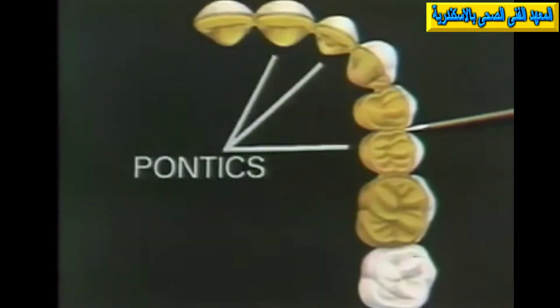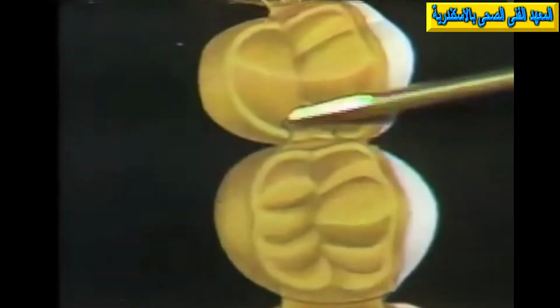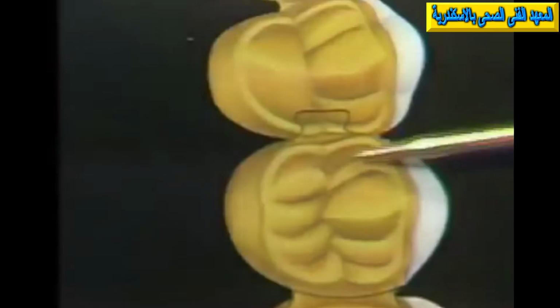If we take a closer look at this semi-rigid connector here, I think you can see that in the design of the occlusal surface of the keyway, which you see in outline here, the functional morphology of the teeth on either side has not been in any way disturbed, nor has the contact relation here. And you can see that the occlusal surface of the keyway has been carved in wax and cast to give a definite marginal ridge relation across here, the occlusal embrasure in between, and a marginal ridge on the other tooth, so that there's no disturbance of the functional form of the occlusal surface or the proximal surfaces in this situation.